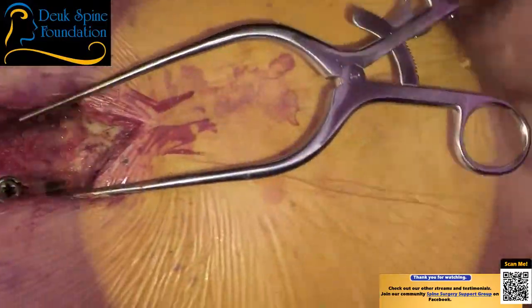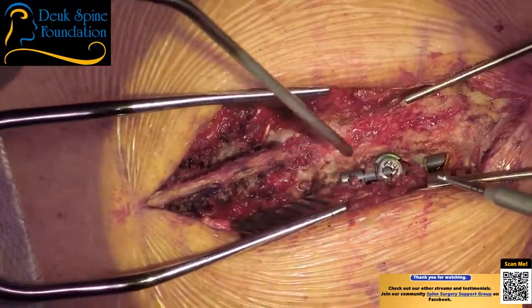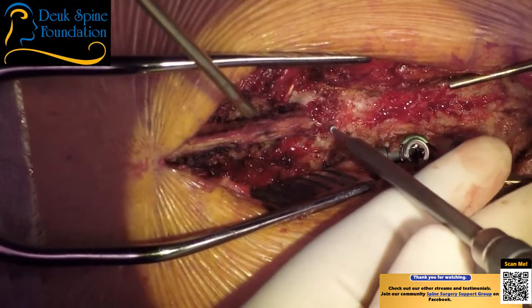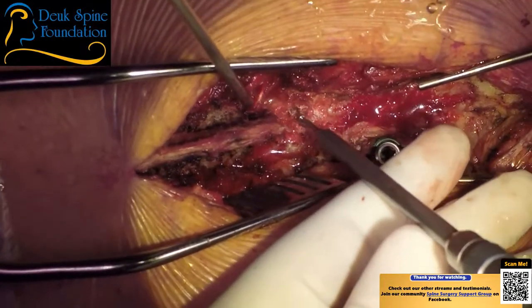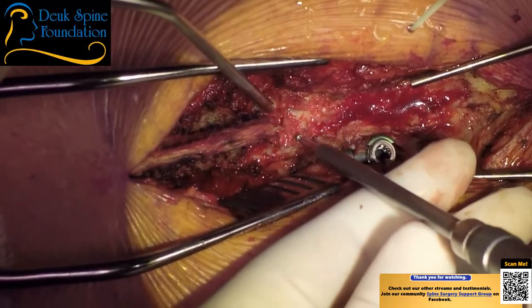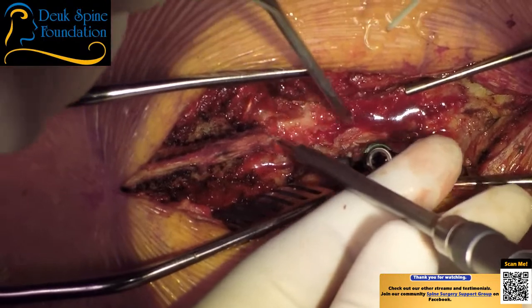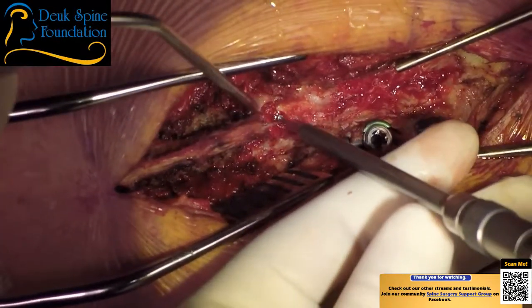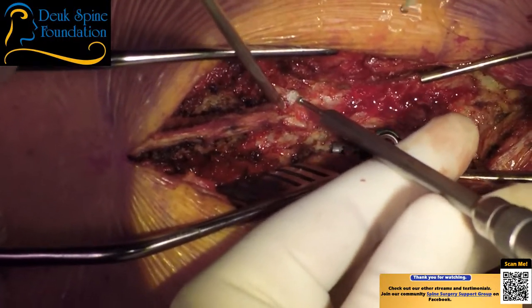Remember, we're not going wide, folks, like I do with a fusion. We're just going narrow. It's called a laminectomy foraminotomy. I don't want to get out in the pars. I don't want to take the pars out. I just want to take the lamina, spinous process, and then I want to undercut, get in the foramen and open it up. So there's the spinal cord right there. Just be careful, there's a little bit of fat just above the spinal cord.